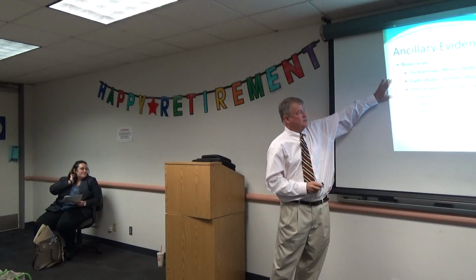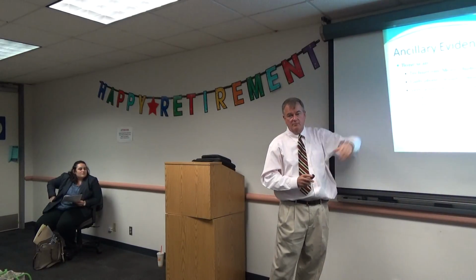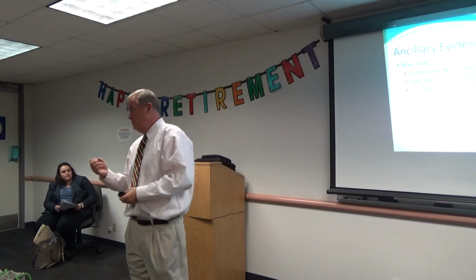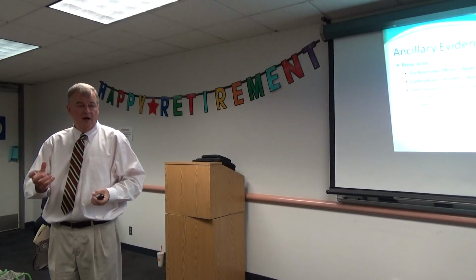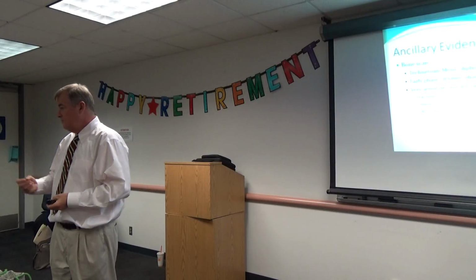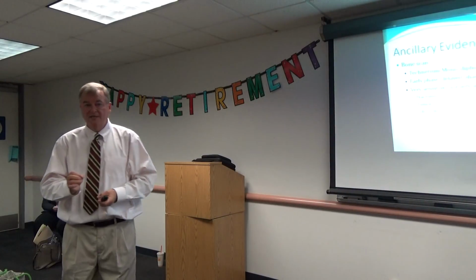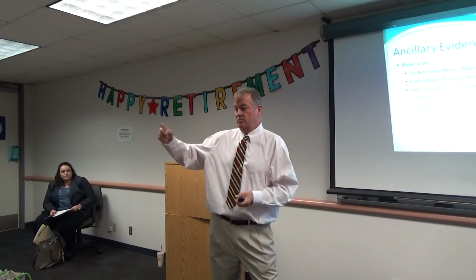You can do bone scans. I used to do bone scans much more frequently because the nice thing about a bone scan is that they found out that bone is made of a molecule called a diphosphonate, the main building block of bone. Those diphosphonates are constantly turning themselves over, and you can take a diphosphonate molecule and tag it with technetium, and inject it into a patient. It will go to wherever bone is turning over.